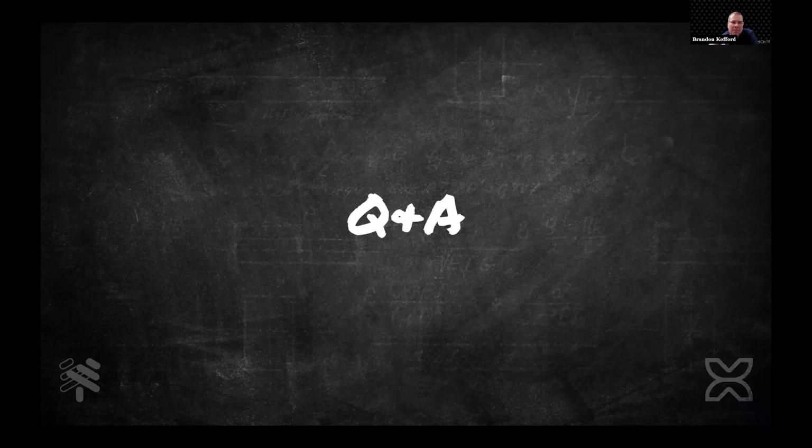Great. So I'm a big believer that I only need one multi-unit abutment tissue height, and that's 2.5, right? In my practice, I only ever use one tissue height: a straight 2.5, a 17 2.5, and a 3.5 30. Now that's in reference to the long portion of the abutment, not the short portion of the abutment.